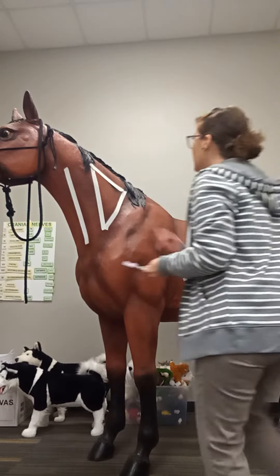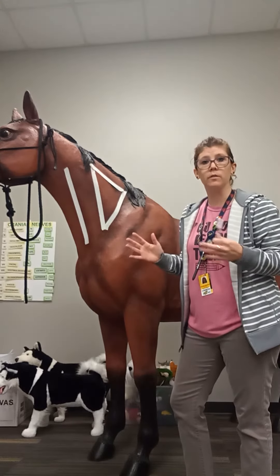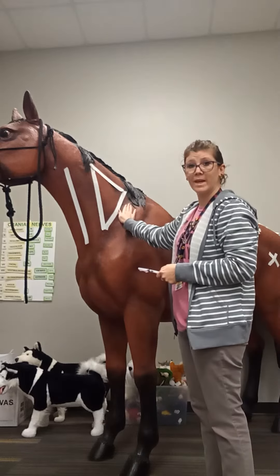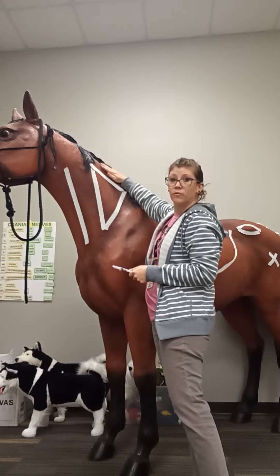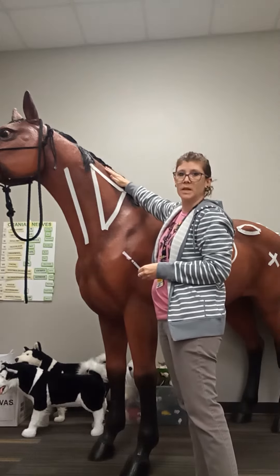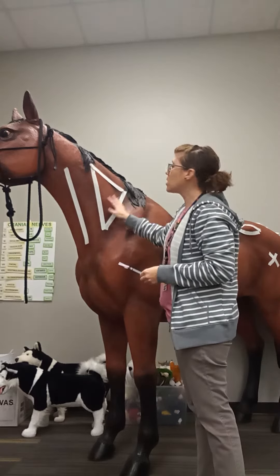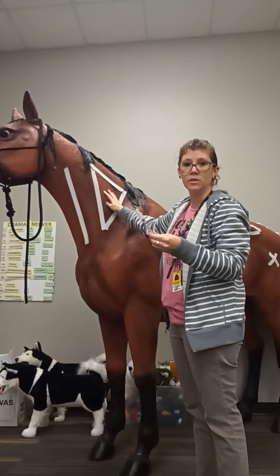You can see we have this outlined area that we're going to go for. In real life you won't have tape on your animal, but you go a hand width in front of the shoulder blade, a hand width from the mane — from what's called the nuchal ligament — and then a hand width from where the jugular vein is. This triangle area is where we give our intramuscular injection.